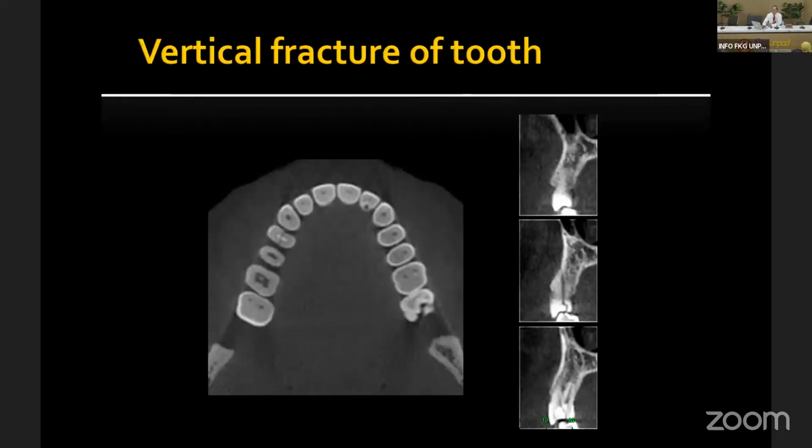Also, sometimes we have a vertical root fracture. Vertical root fracture is sometimes very difficult to diagnose in the clinical situation, particularly if the orientation is mesial-distal like this one. On the intraoral radiograph, you may have a hard time seeing the vertical root fracture.